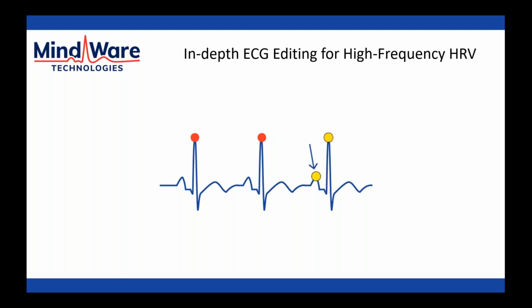Another common occurrence would be that the peak detector finds a peak on another one of the waveform characteristics. In this case, it looks like a P wave has been identified incorrectly as an R peak. And this can happen again sometimes just based off of cycle by cycle morphology. It just kind of happens. In this situation, you would simply delete this.